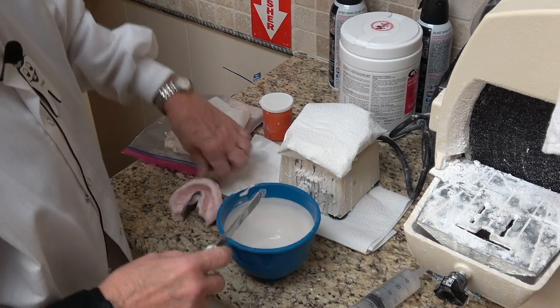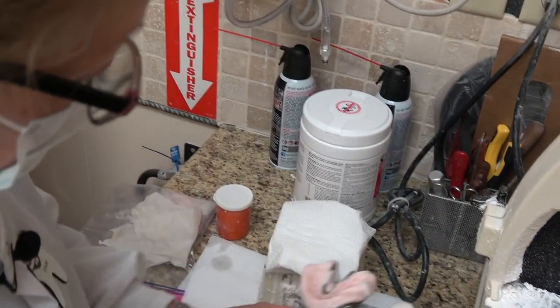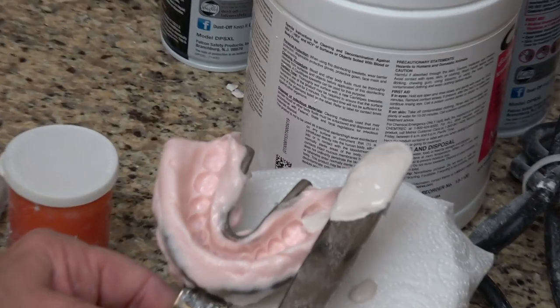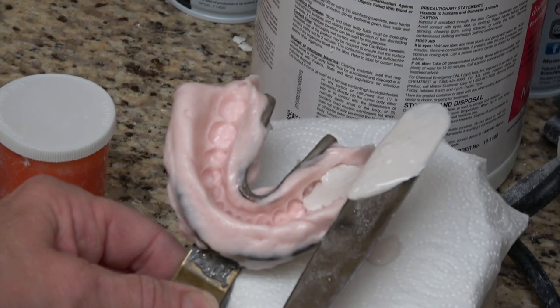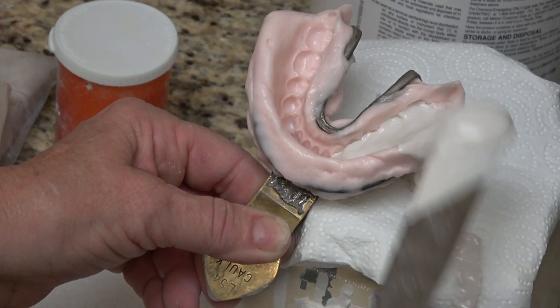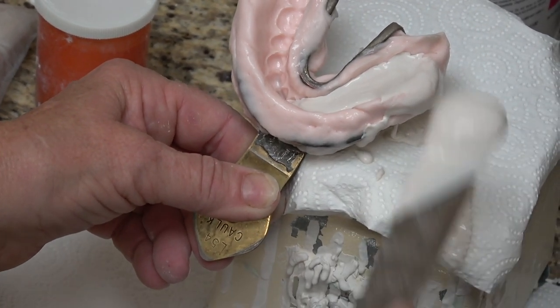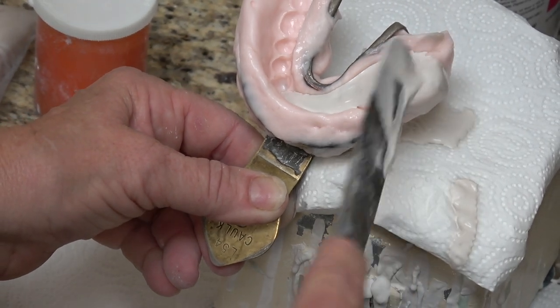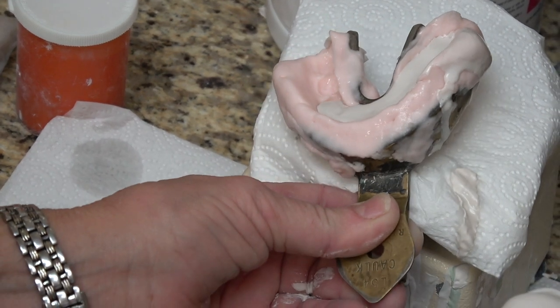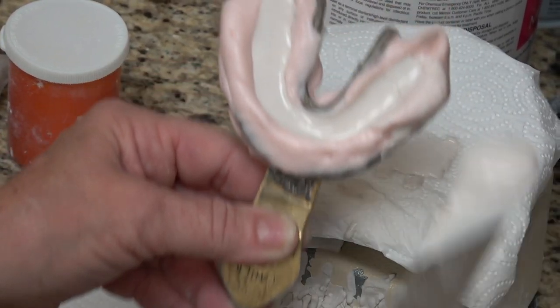You want to start on the right or left, whichever you prefer. Start at the back and let it flow into each tooth. Just grab up a little bit more but start where you were before. Main thing — don't vibrate it any more than you have to. That's all the vibrating I do.